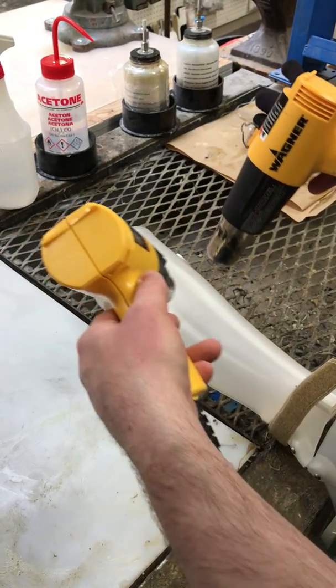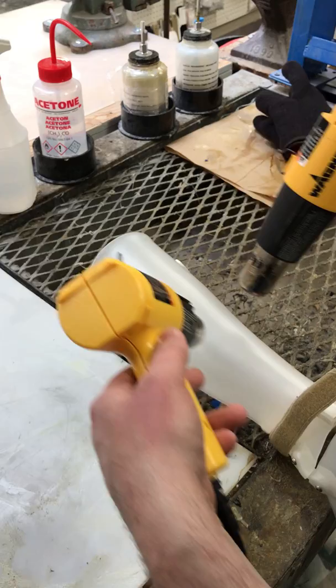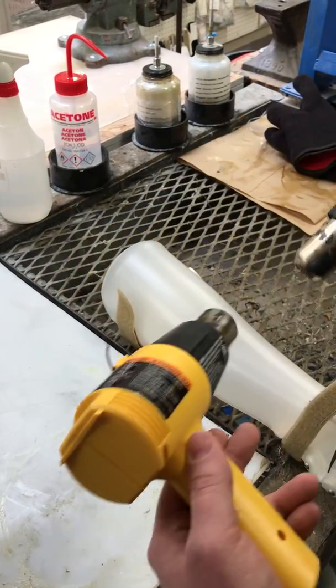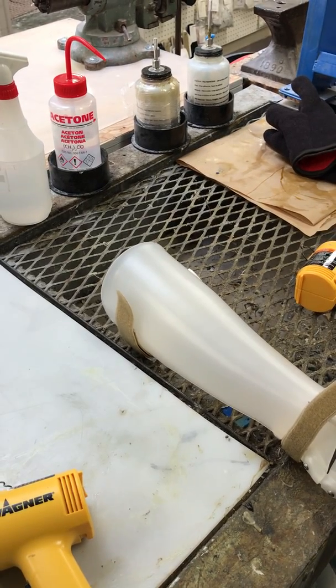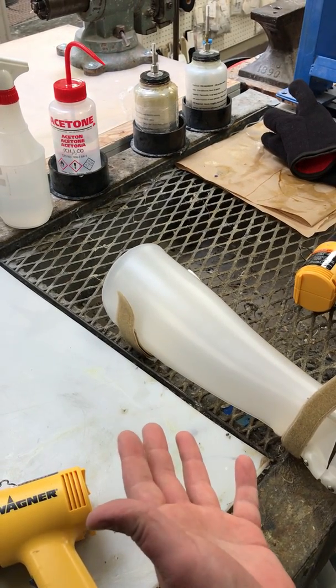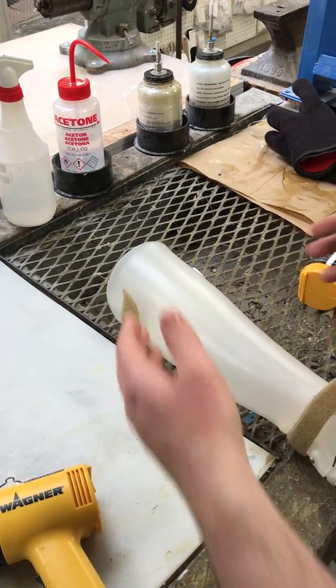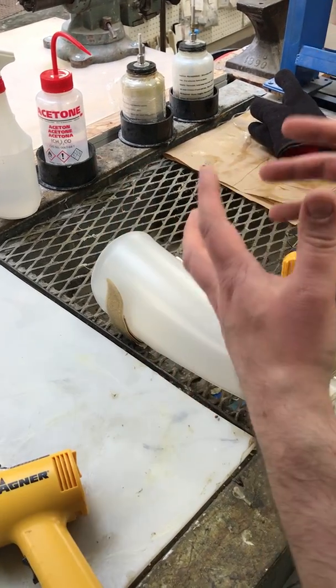You just keep heating, and then it'll get a little bit clearer as we're used to. Once you're ready, you let it either cool by itself naturally or use compressed air to cool it down faster. When you release the velcro, it will be to your new dimension.